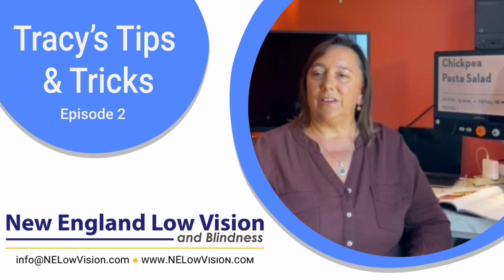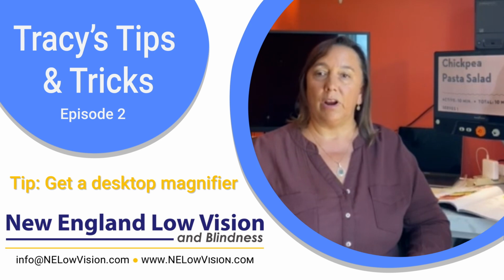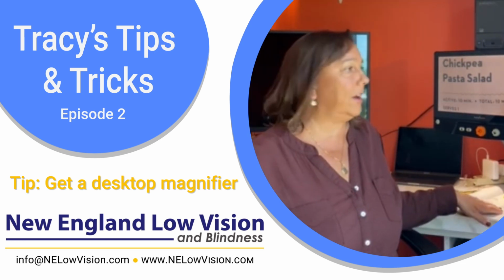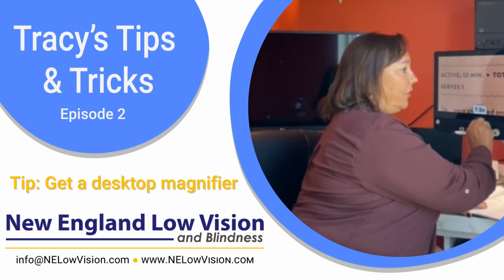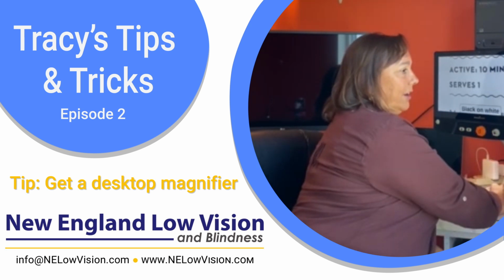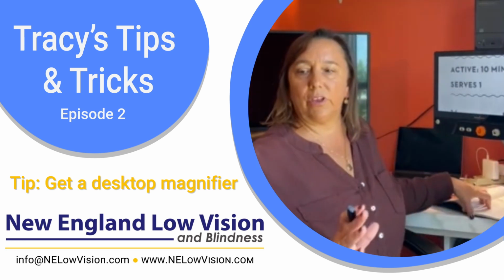So if I was going to list tips, number 1, get a desktop, because it's going to give you the ability to see the most amount of print at once. You can write underneath there, you can put phones, iPads underneath there. I've got one here on my desk right now. I've got a recipe here. I can make the print as large as I want. I can change the contrast. As I said, I can write, fill out checks, all that good stuff, crossword puzzles.